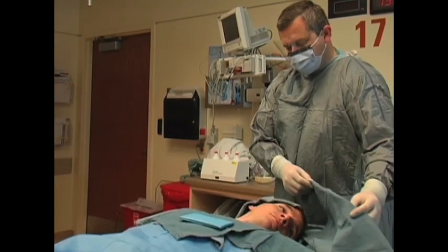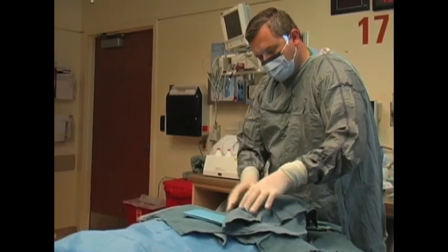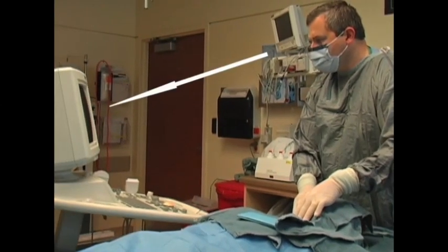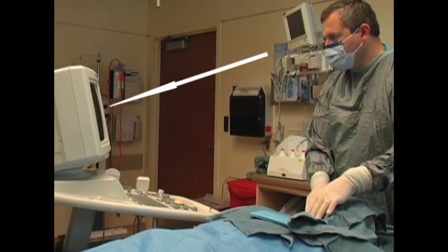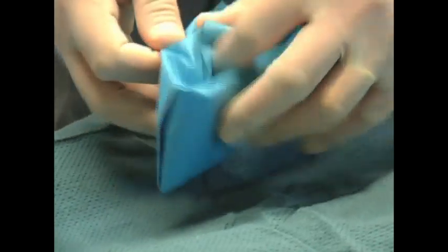We'll demonstrate the middle approach first, using the right internal jugular vein. Dan is having the machine positioned so that it's at the patient's right side, and the screen is in his direct line of sight, so he does not have to turn his head while he's performing the procedure. The patient has been prepped and draped in sterile fashion, and now we need to prepare the transducer.